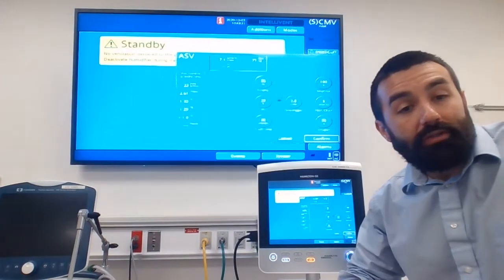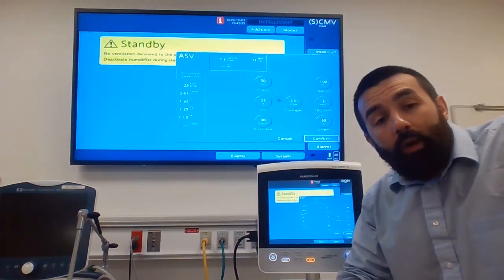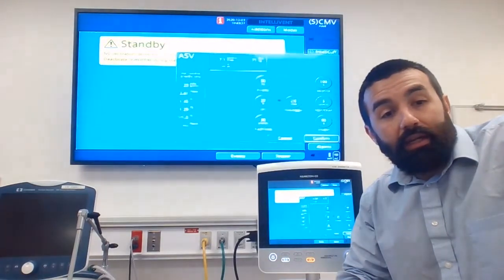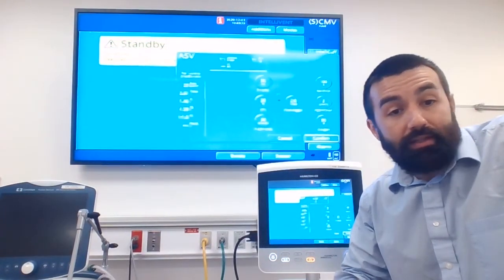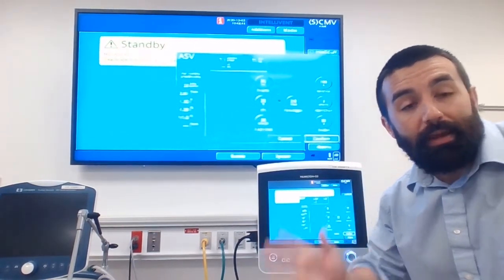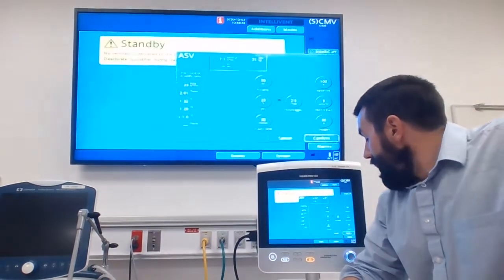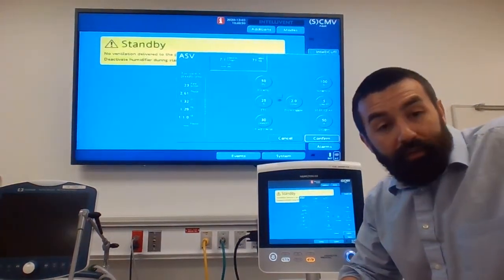It's going to give those targeted tidal volume breaths as pressure. So if that patient is not breathing, it's going to give those breaths at a certain size and a certain rate. It's going to dictate the I time based upon looking at that patient's time constants and making sure it gives enough time for exhalation. And pretty much it's going to achieve the minute ventilation like that.